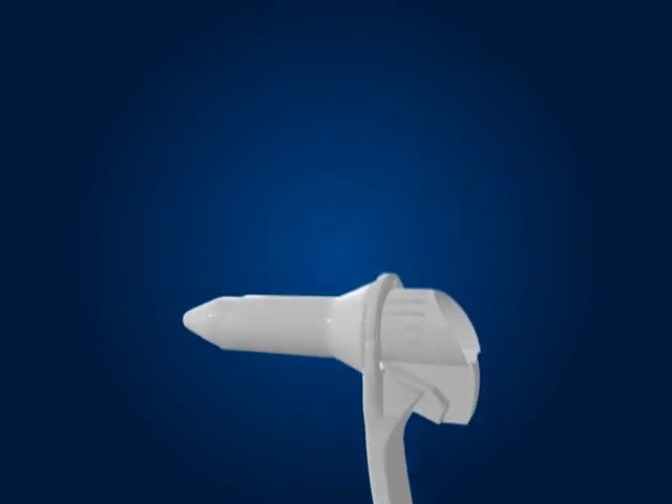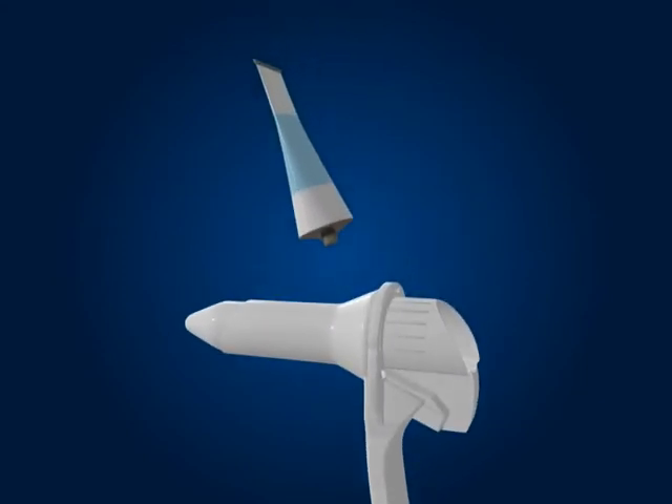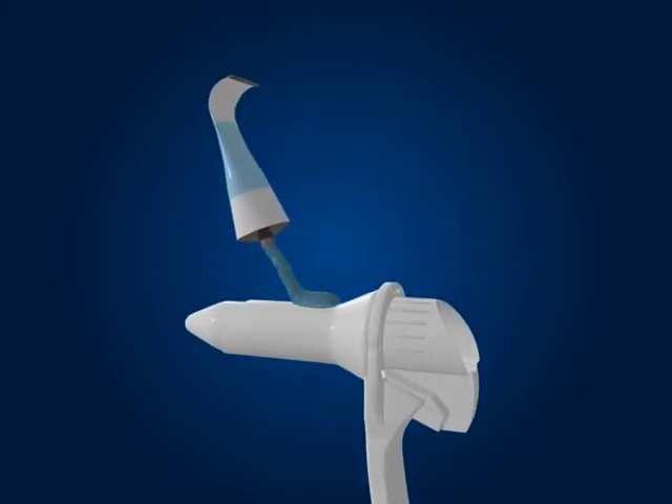Using a sterile water-based lubricant, lubricate the exterior of the device and the rectal area.